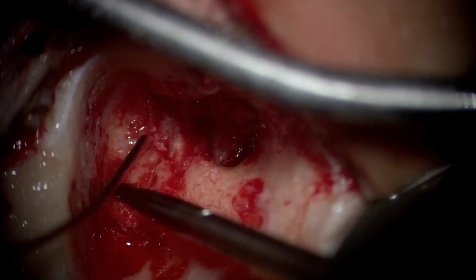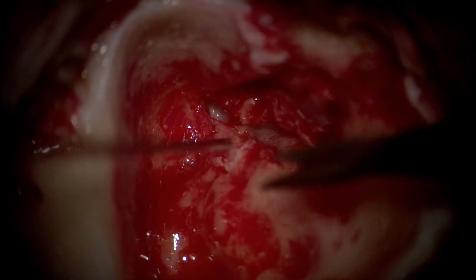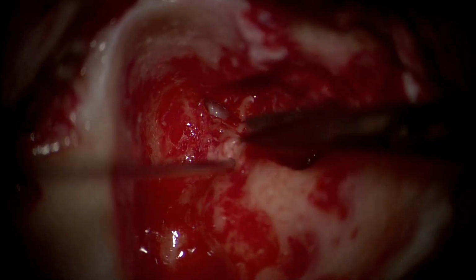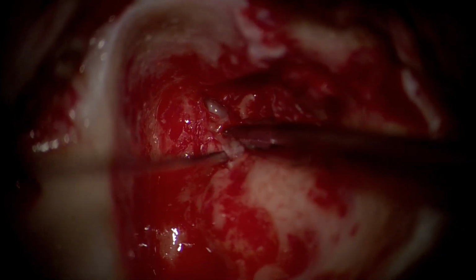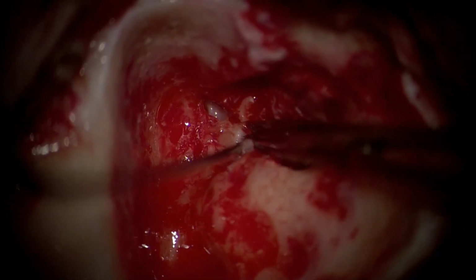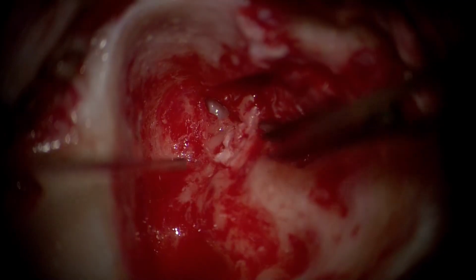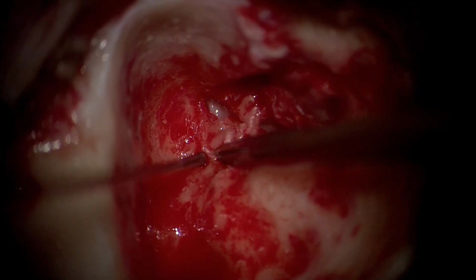So here you see we are removing the fused ossicular heads with some portion of the malleus head and the body of the incus, and we have resected it using a nipper. And now what you see is cholesteatoma. It is lying exactly at the level of the genu, and it is very important to clear it completely without traumatizing the footplate and without traumatizing the facial nerve, because dehiscence of the facial nerve is very, very common in this segment, even if the CT fails to demonstrate that.